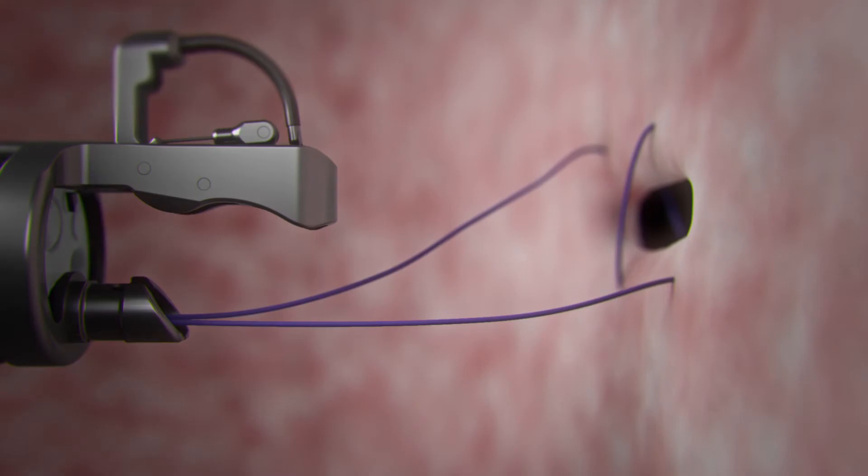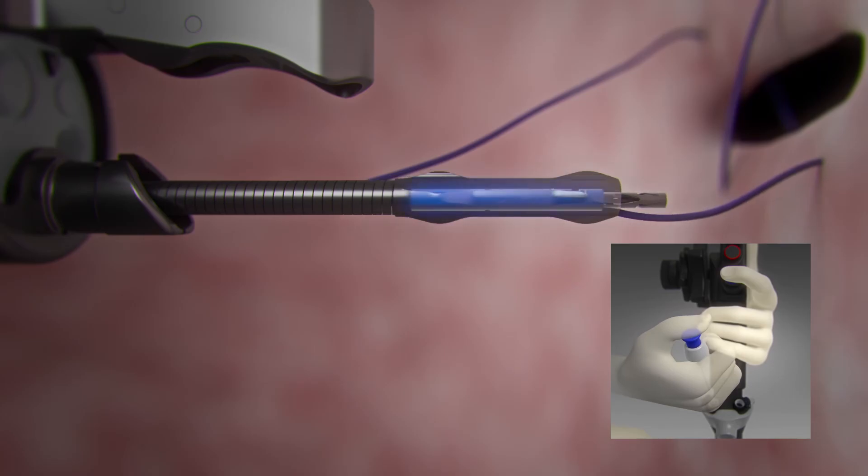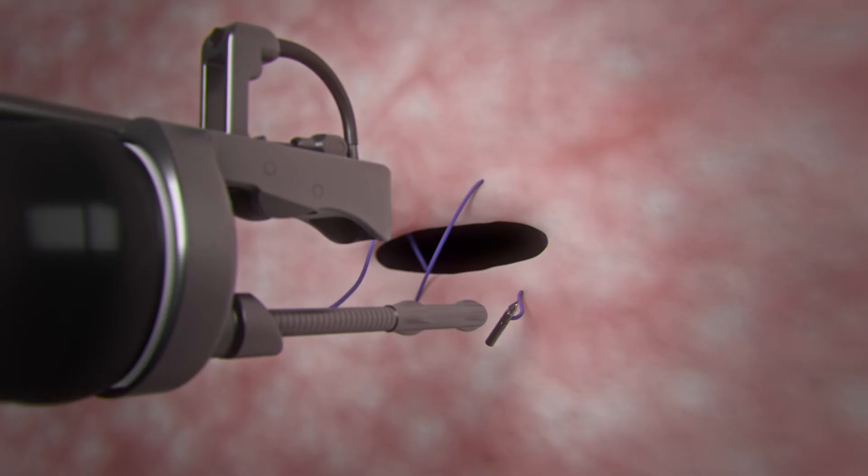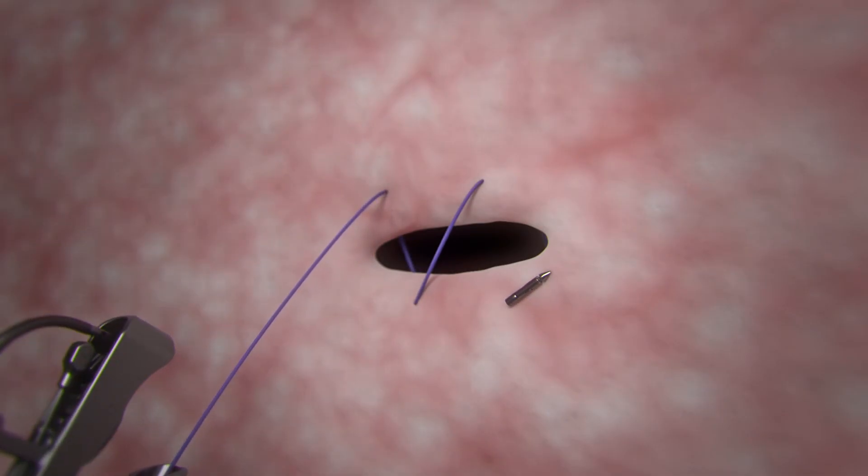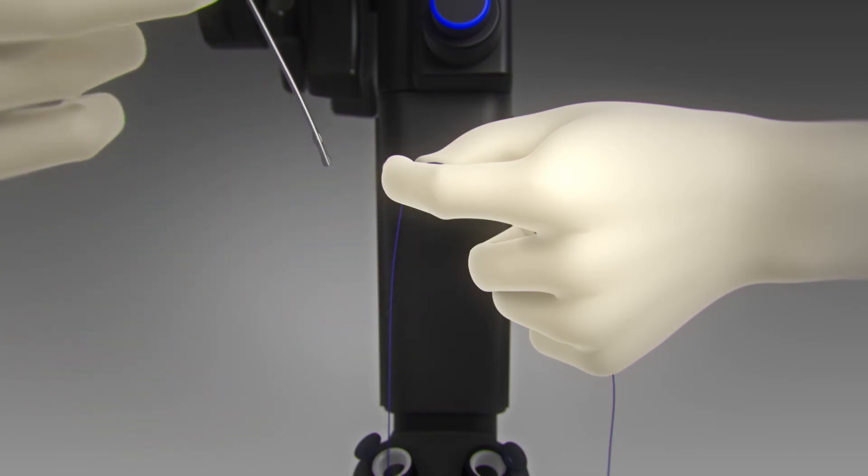To prepare for cinching, extend the anchor exchange catheter approximately 3 centimeters past the end cap. Press the blue button and pull back on the anchor exchange to release the anchor. Remove the anchor exchange catheter from the 3.7 millimeter scope channel, leaving the suture in place.